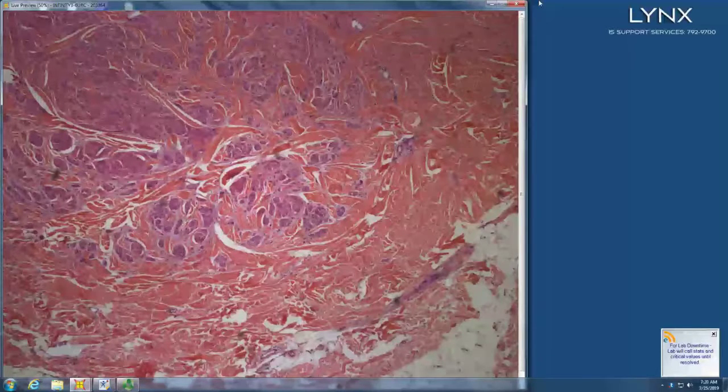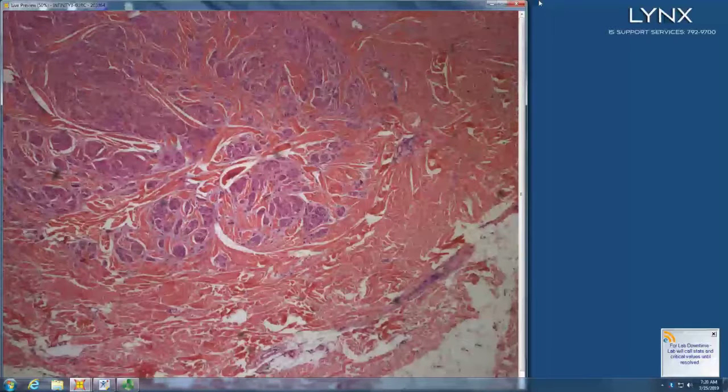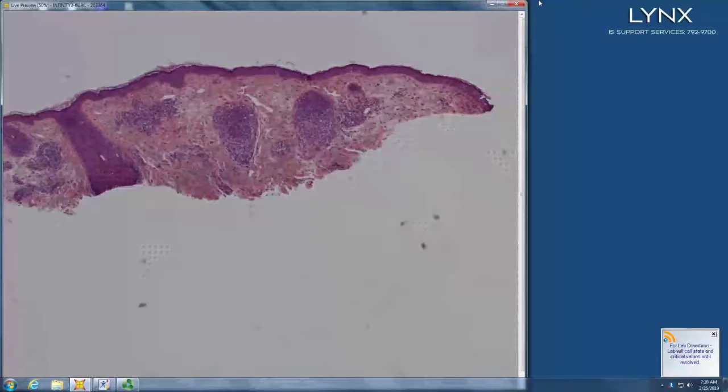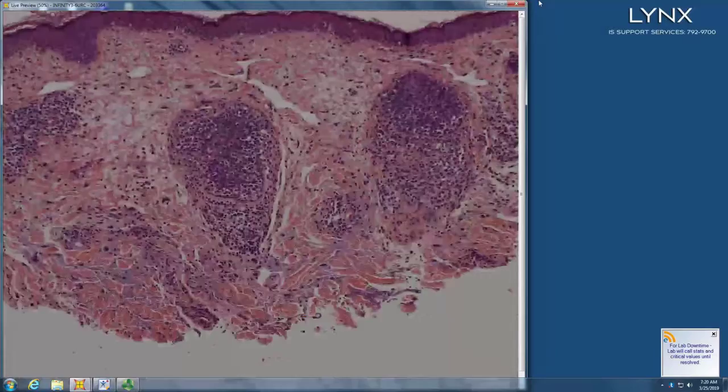The soft tissue people would say atypical smooth muscle tumor, because if it doesn't metastasize, they don't want to call it sarcoma. But it's more widely called leiomyosarcoma. And given that it will infiltrate right down into bone, it's not a bad designation. Very clear.